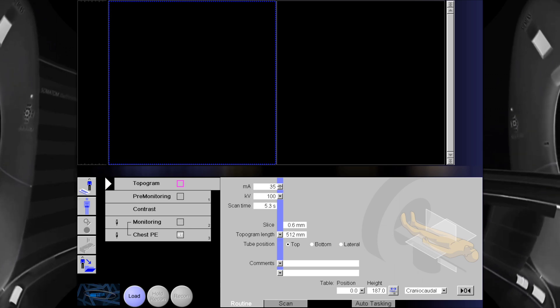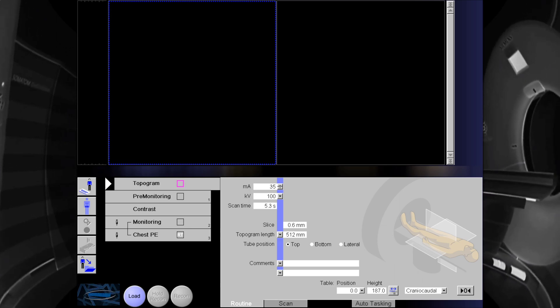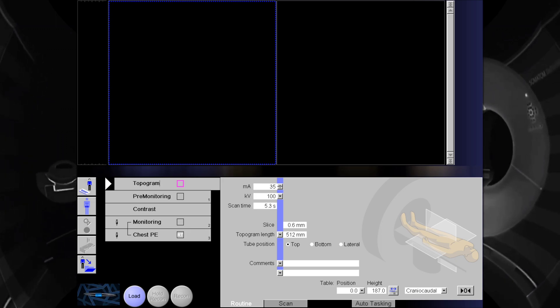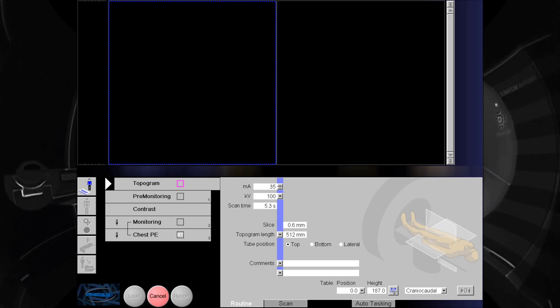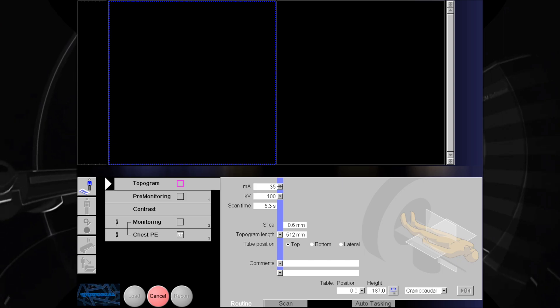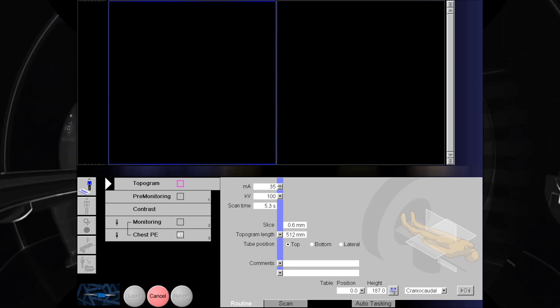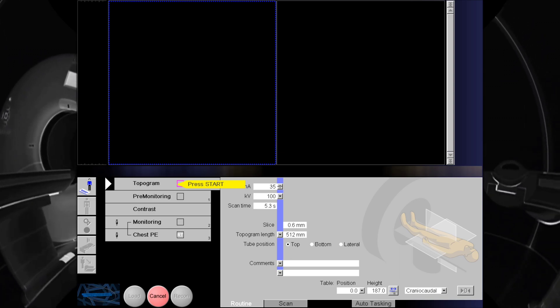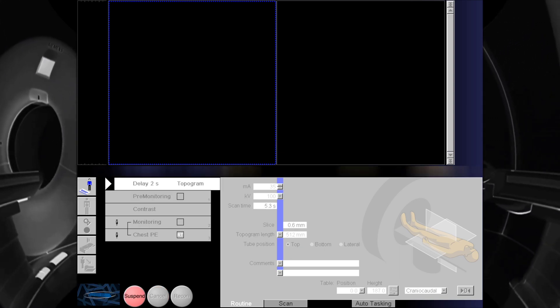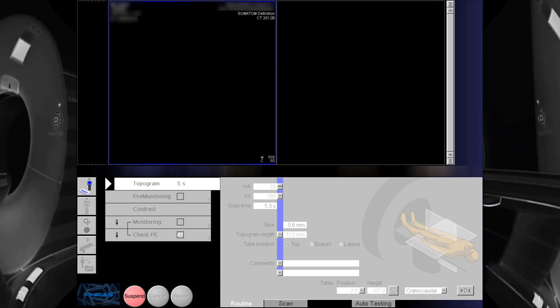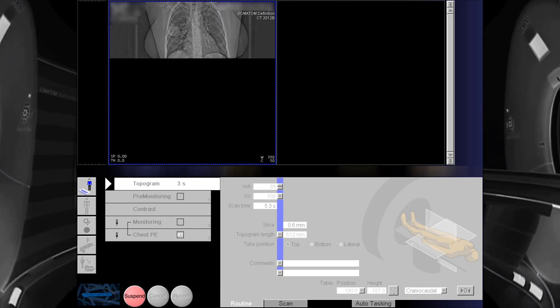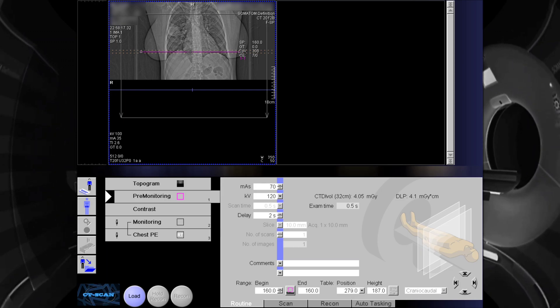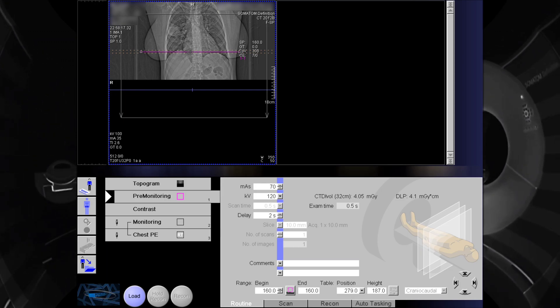Let's begin with our case. Take topogram of the chest. Instruct patient to hold breath before pressing the scan button. Inform patient to breathe normally after the scan.